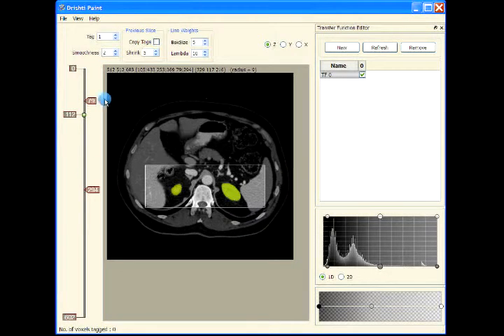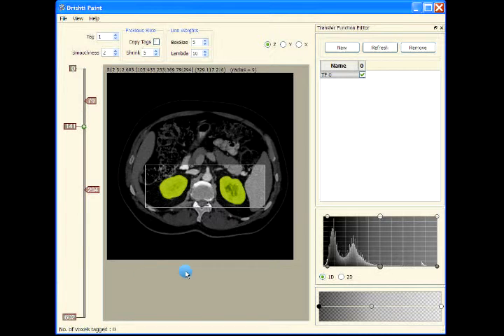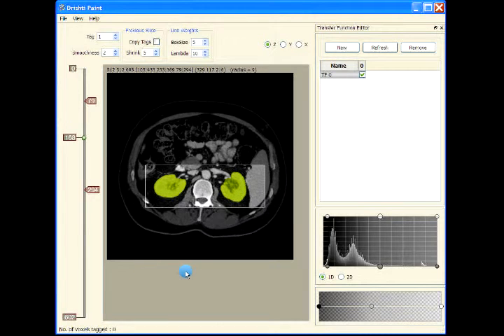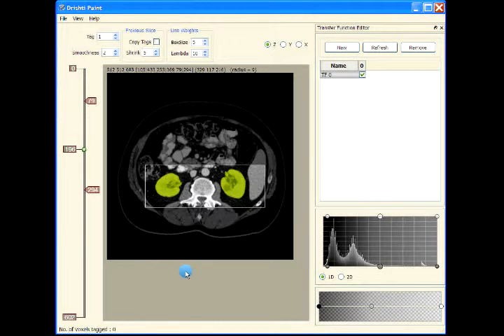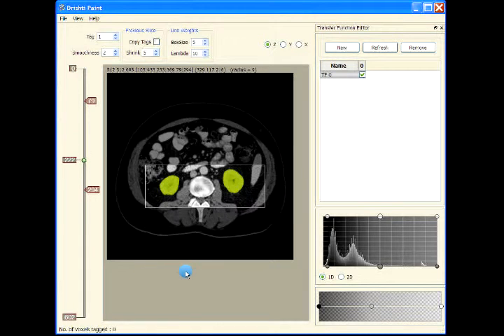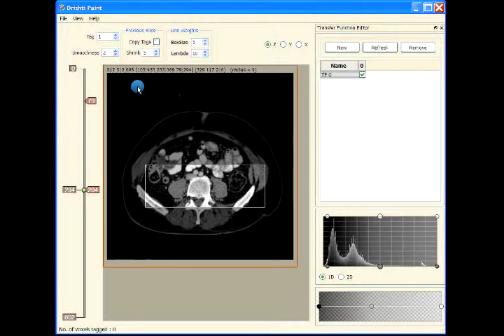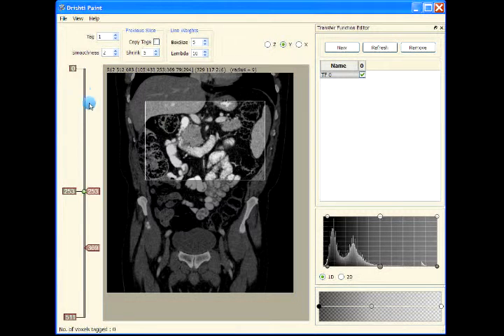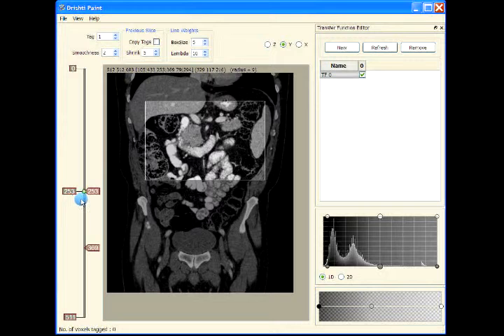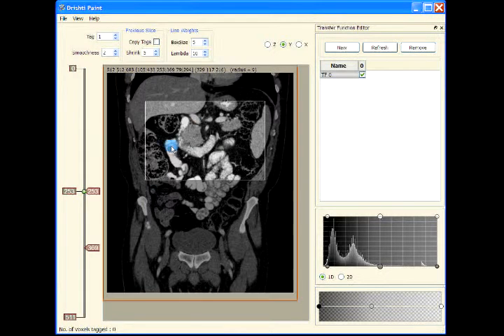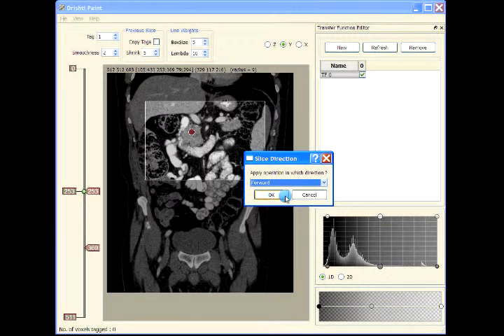Press Shift+D and I'm just dilating things a bit — Shift+D forward. Let me just turn up the tags; we don't need to copy the tags, just let the process go a bit faster. We have applied dilation in the slice direction and will also apply slight dilation.